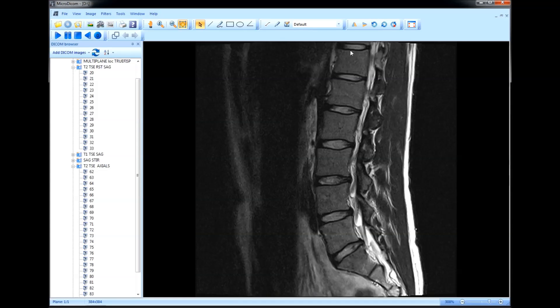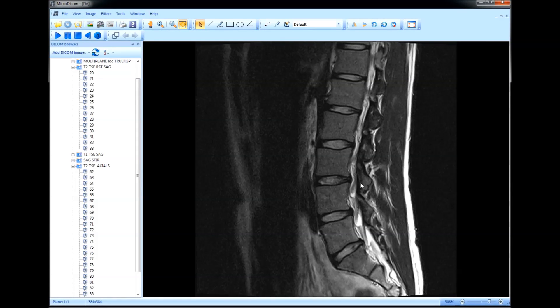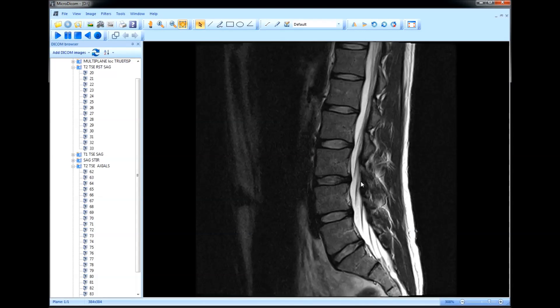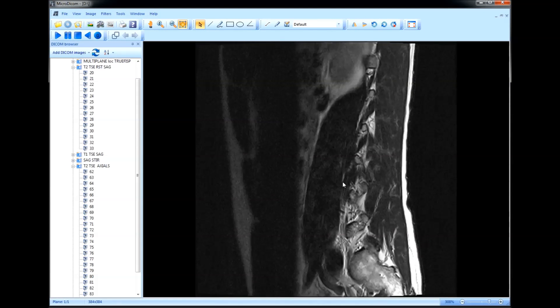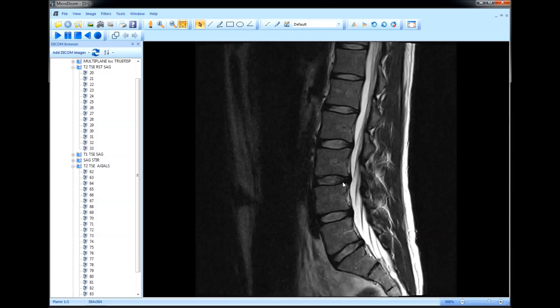So T12 is thoracic vertebra number 12, followed by lumbar vertebrae 1, 2, 3, 4, and 5. It's important to count this way because sometimes the vertebrae might be fused with the bones of the sacrum in a process called sacralization, so being able to count from T12 helps avoid confusion from vertebral anomalies.